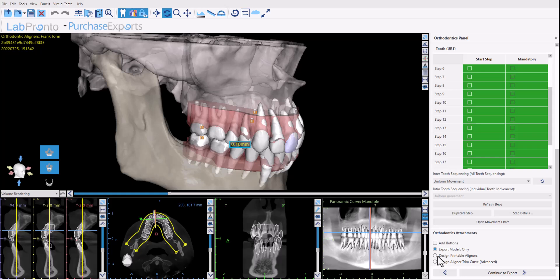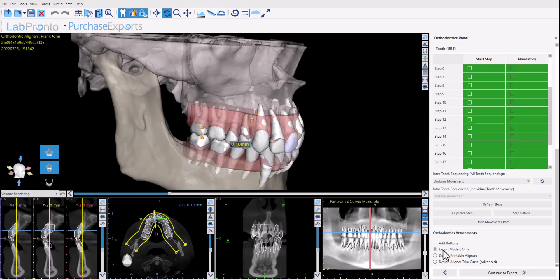In this tutorial we're going to present the default flow of exporting the models only for aligner manufacturing. So after the aligner teeth setup is completely done and the teeth movement has been confirmed and you've added any buttons or attachments that are relevant, make sure you have the export models only option selected and click continue to export.